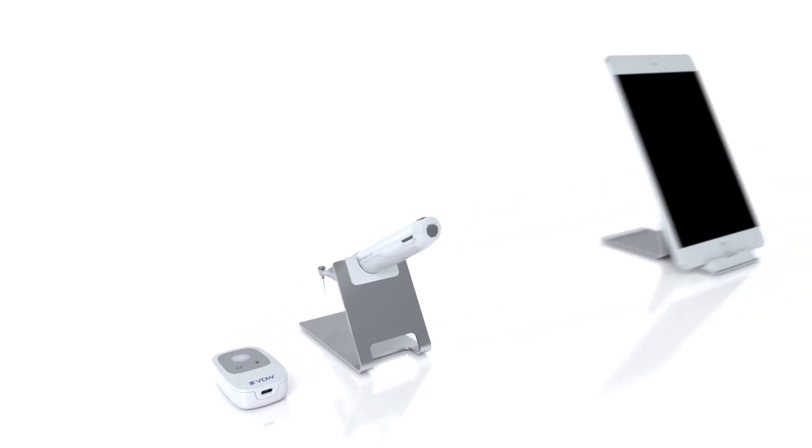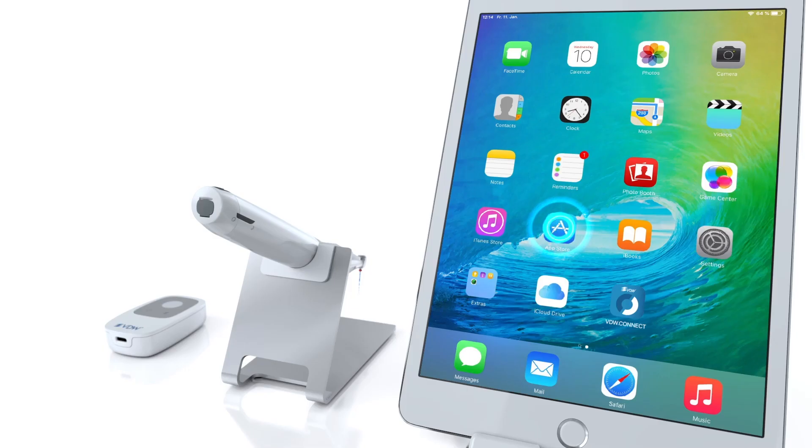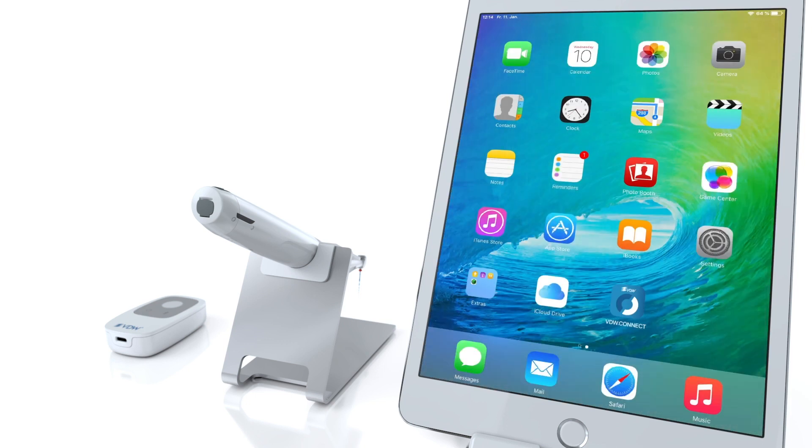When you want to combine the VDW Connect Locate with the VDW Connect Drive and the Connect app, you have to connect all three devices. To do so, first download the Connect app from the Apple iTunes Store, install it on the iPad and open it.